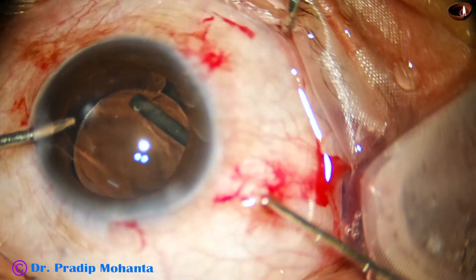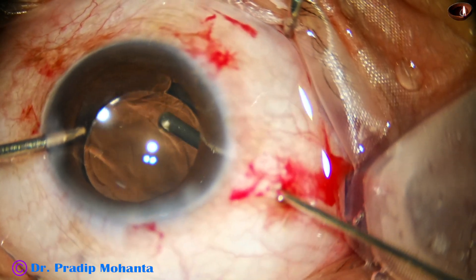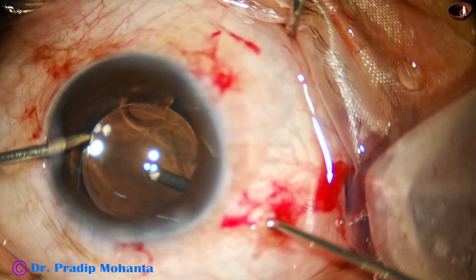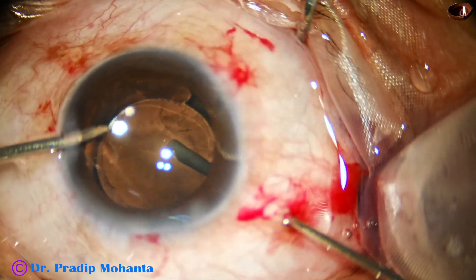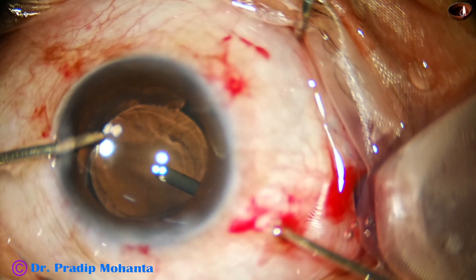While we do anterior vitrectomy, the cutting port should be directed down towards the optic nerve. At some points in this case, you will see that I am towards the posterior capsule — that should not be. We may accidentally touch the posterior capsule and make an inadvertent posterior capsulotomy. So the cutting port should be directed towards the optic nerve, not towards the posterior capsule.